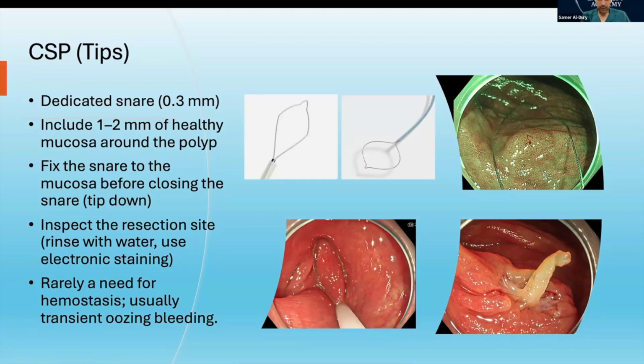Okay. And in terms of the shape, the stiffness, and the size of the snare in daily practice, do you have any preferences or recommendations? Let's say we should not focus on just the brands. I know we all have our preferences, what's locally available and what we like to use. But in terms of the fundamentals, what would you prefer? How big would you prefer them to be, and what shape do you like, and so on?